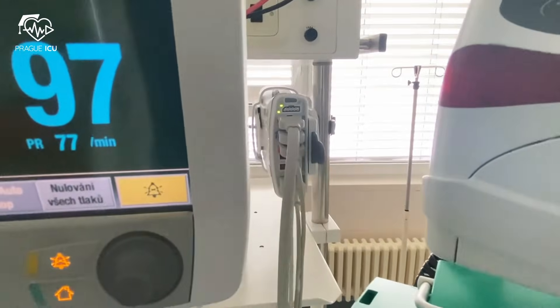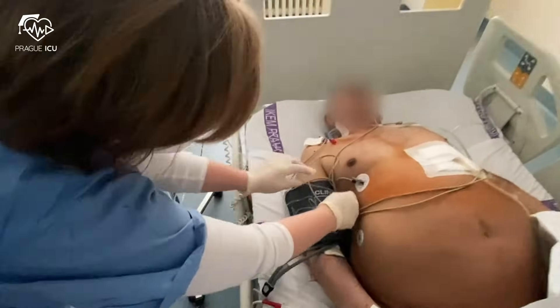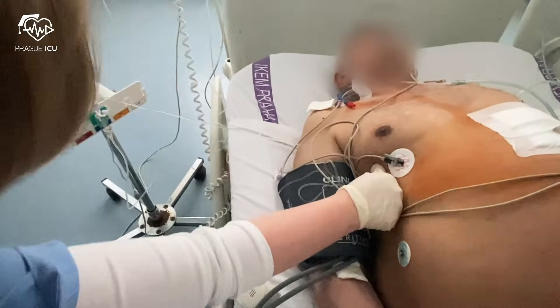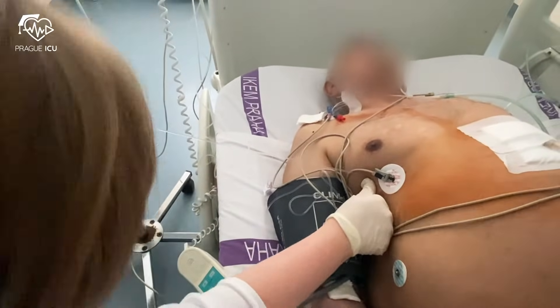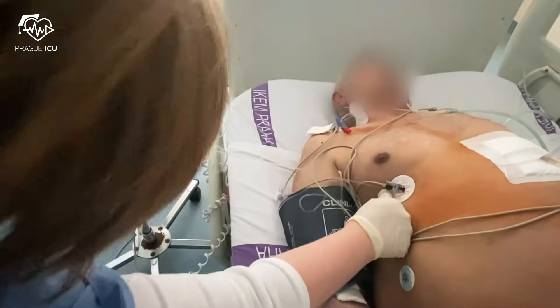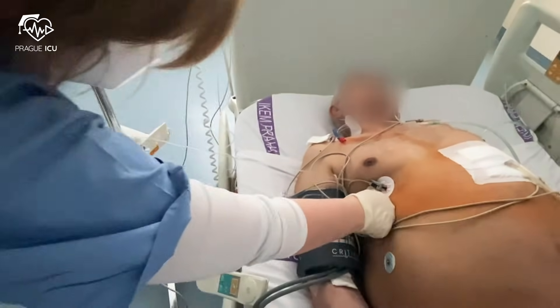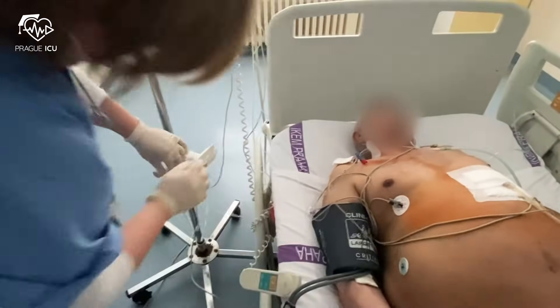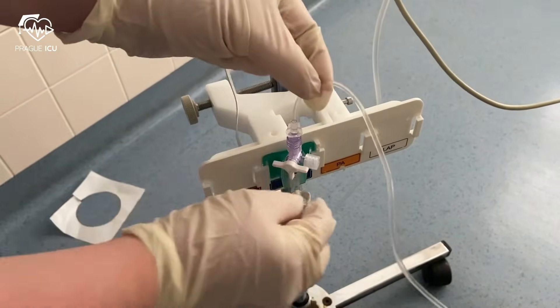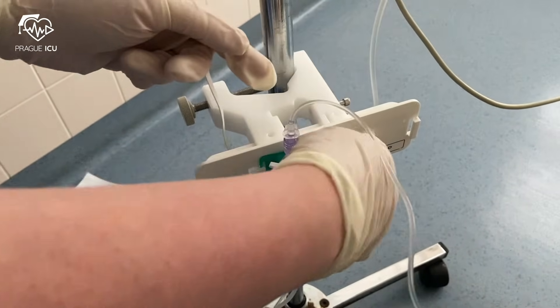For accurate pressure detection, the patient should be placed in the supine position and the transducer needs to be leveled at the patient's phlebostatic axis. It is located by drawing an imaginary line from the fourth intercostal space at the sternum and finding its intersection with an imaginary line drawn down the center of the chest below the axilla.